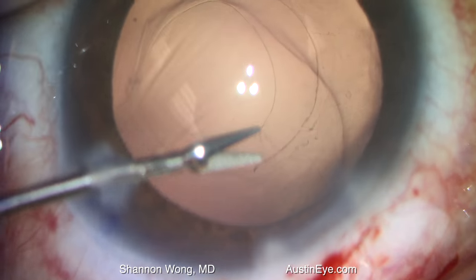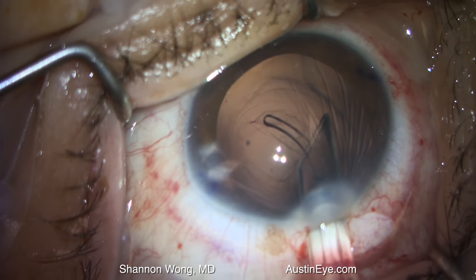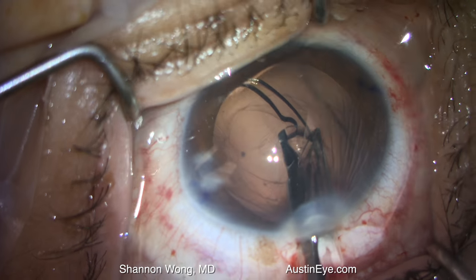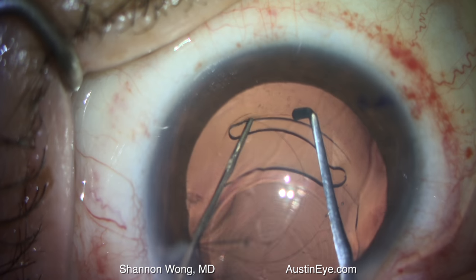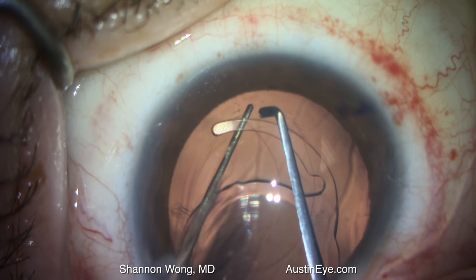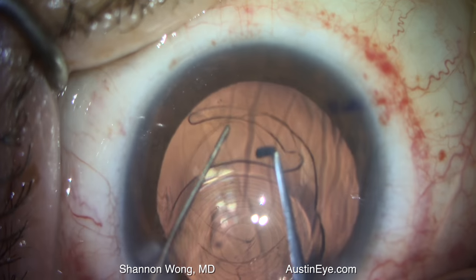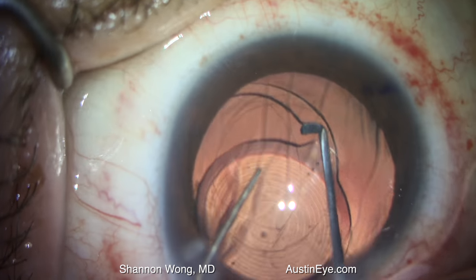That small nick in the anterior capsular rim will become an issue as we place the lens into the capsular bag and try to dial it in. You'll see that the small nick extends within the anterior capsule and makes the case more difficult.